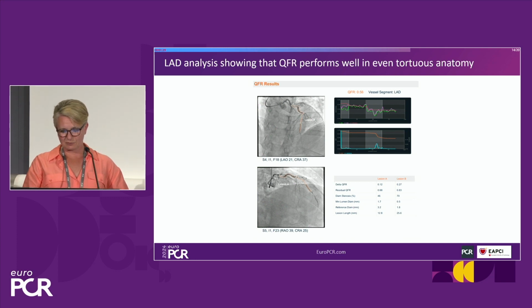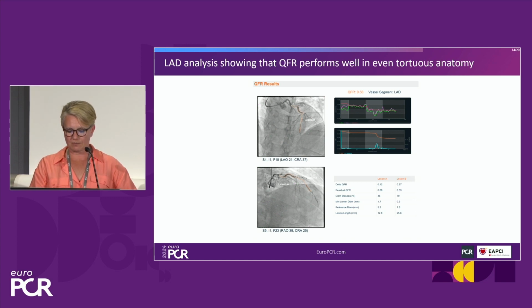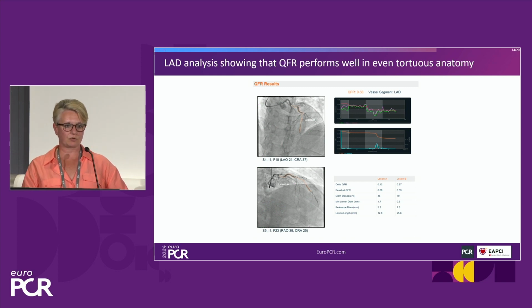And indeed, instead of going to the surgeon, we again did first LAD analysis. And you can see that this LAD vessel is very tortuous. So I think QFR here is positive, of course, but there are some cases where when you have such a tortuous vessel, your FFR will be falsely positive and the QFR will show that the actual vessel is okay. So it performs well even in tortuous anatomy.